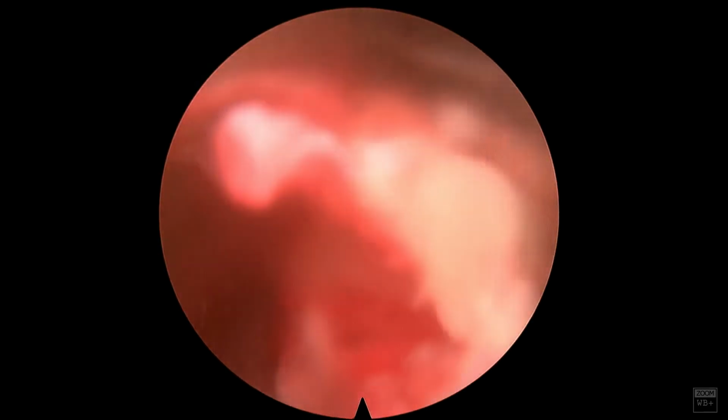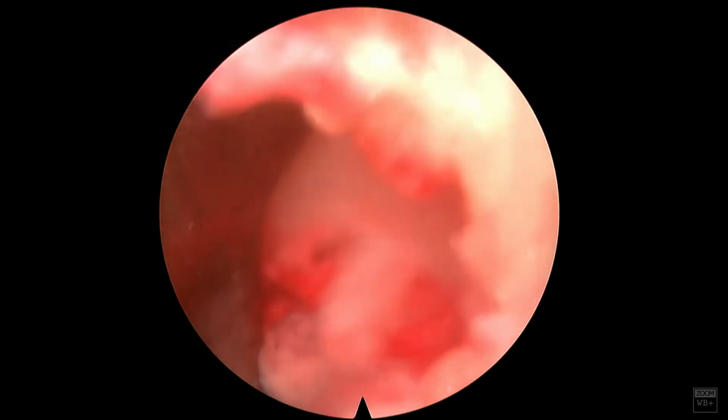You notice the transforaminal disc herniation, a little bit of a far lateral nature to it, a little bit of a high intensity zone into the paracentral region of the L5S1 disc. So I'll kind of go over my initial starting point for endoscopic transforaminal discectomy.